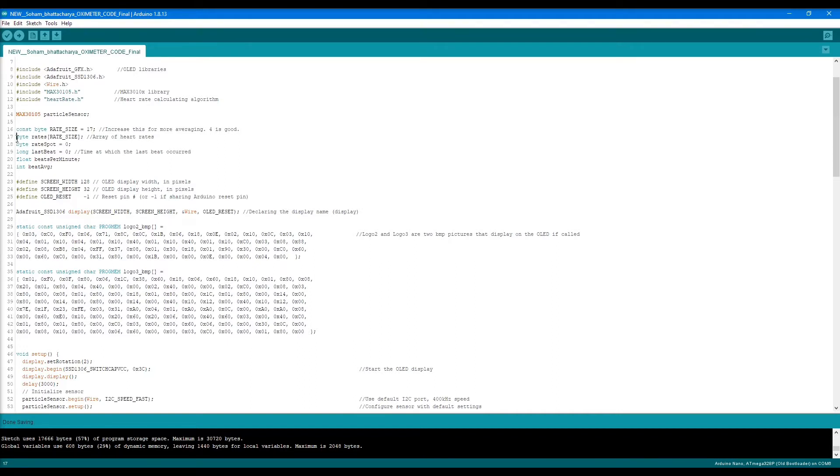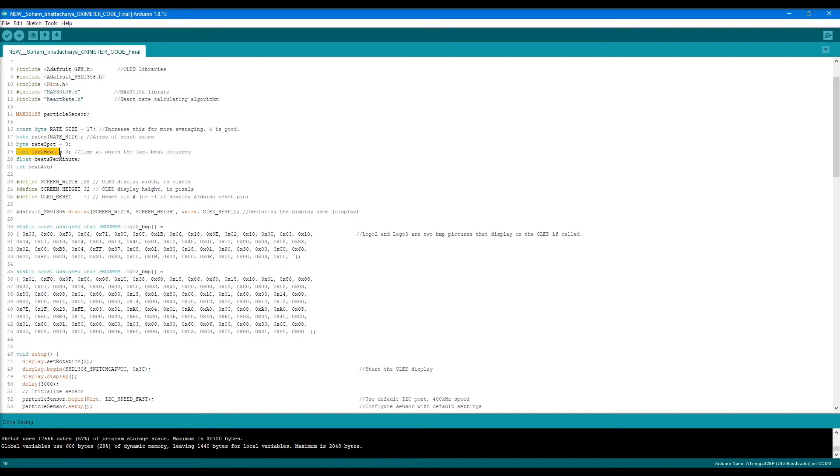In line 17 is the array which stores the heart rate. In line 18 is the heart rate spot initialized as zero. There's also last beat, initialized as zero. This variable assesses the time at which the last beat occurred, as defined here.